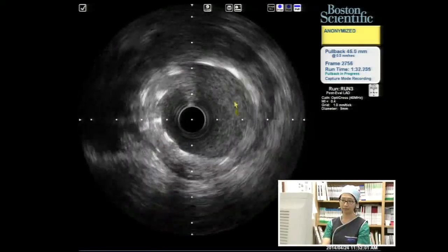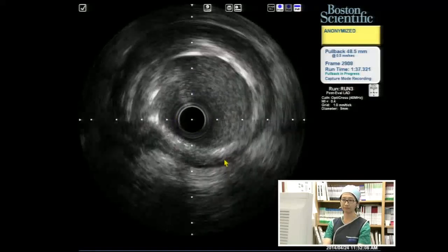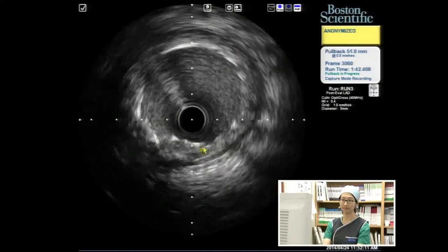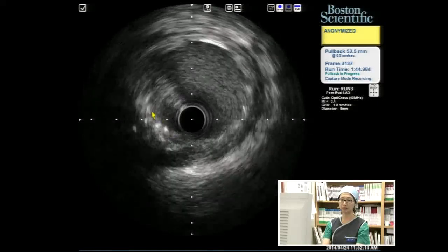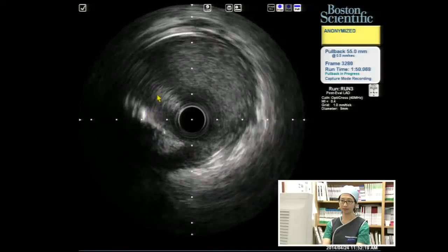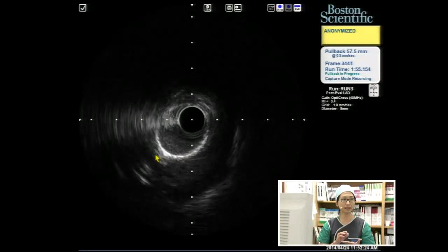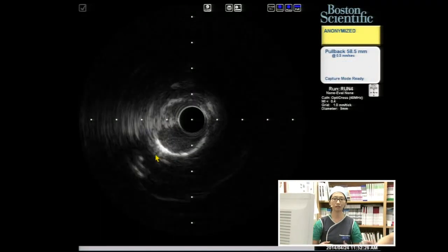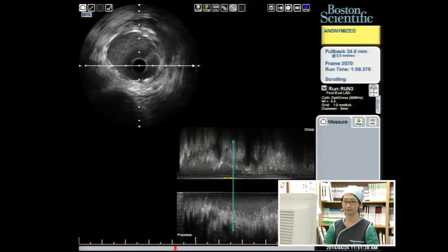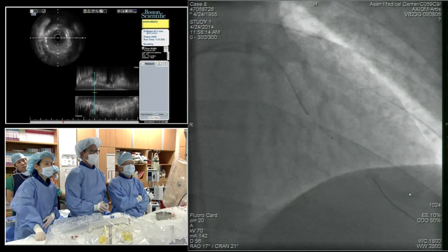Yeah. And here is the left main stent, and it's larger than 8 square millimeter. Yeah, you see the apposition with that soft plaque is very good. Yes, throughout circular. Yes, some plaque protrusion here, but it's very minor. Actually, it's quite good. Yes, and the left main ostium is not covered with the stent, but as long as the plaque is minimal, there is no relationship with the clinical outcomes. I think we landed in a pretty good spot in the left main. There's really not a whole lot of plaque there. If Dr. Khan can show that again, I think we don't have to worry too much.